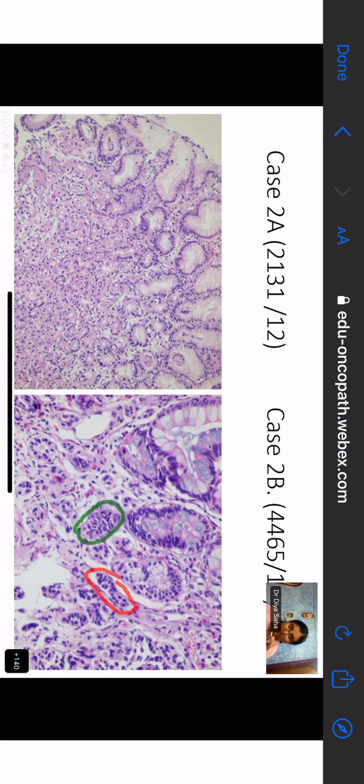Yes. What are they having? Ma'am, some of these cells are triangular, there are many nests, and they have scant cytoplasm. So I thought this may be nest of neuroendocrine cells.